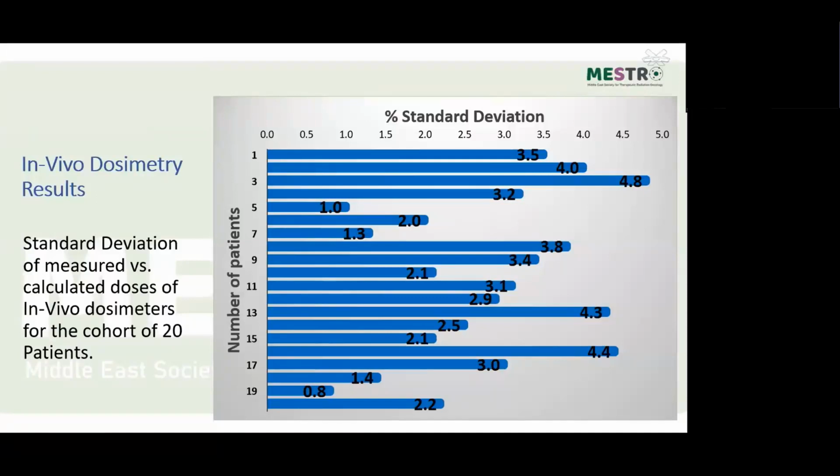And this is for 20 different patients, which shows that the results have been improved with the help of patient setup, with the help of WED calculations, which are CT-based, and with the help of in vivo dosimetry.